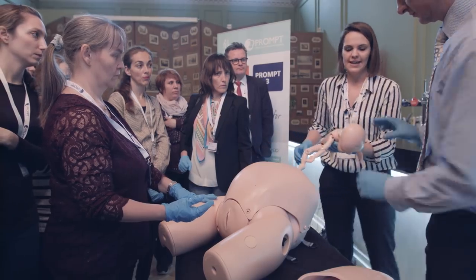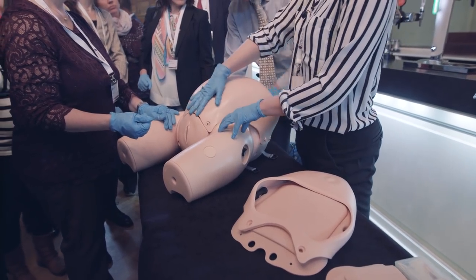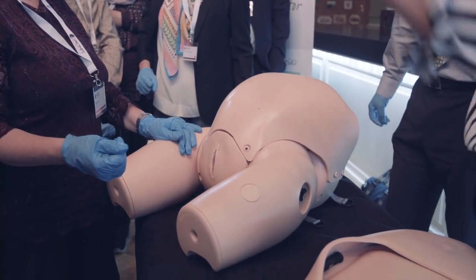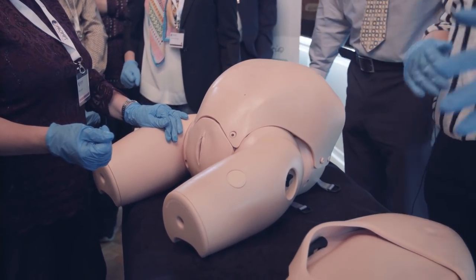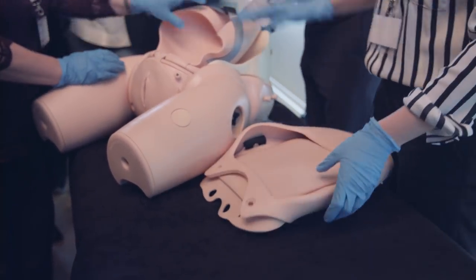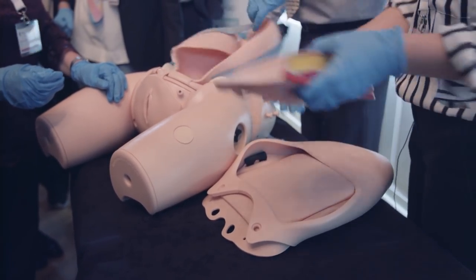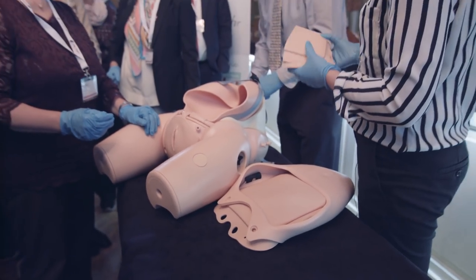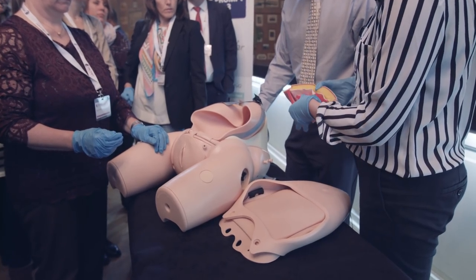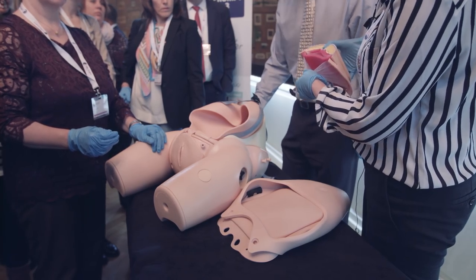With the skin off, if you're concentrating on one thing like deeply impacted fetal head it's good to keep it simple and just use this skin. But particularly for more junior trainees, if you want to teach the whole caesarean section from knife to skin to closing, there are these caesarean section skin modules. You put that in instead of the skin and you can use a normal scalpel to cut through — it has all the layers: skin, cutaneous fat, sheath, rectus muscles, the peritoneum, the bladder, the uterus, and then the membranes.